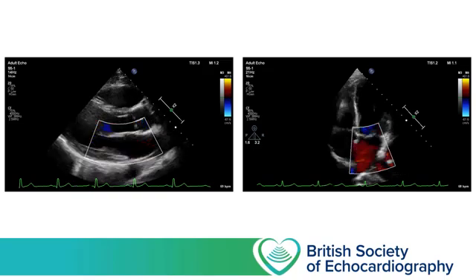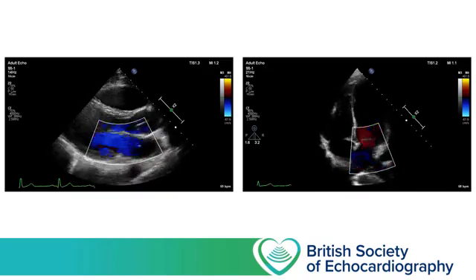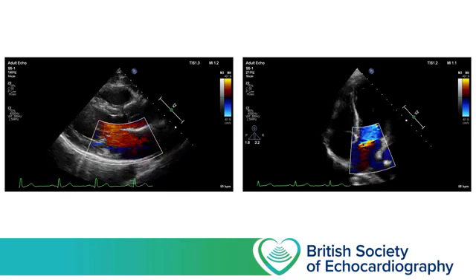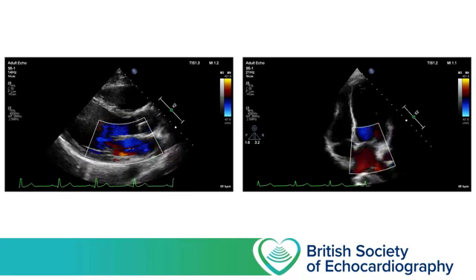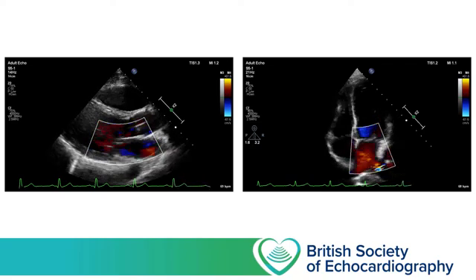Once again, the scale should be set to between 50 and 70 cm per second, and the box should be placed such that it covers the mitral valve leaflets throughout the entire cardiac cycle, as well as the left atrium. Only the basalmost portion of the left ventricle needs to be covered, as we're principally using this colour box to look for regurgitant jets.